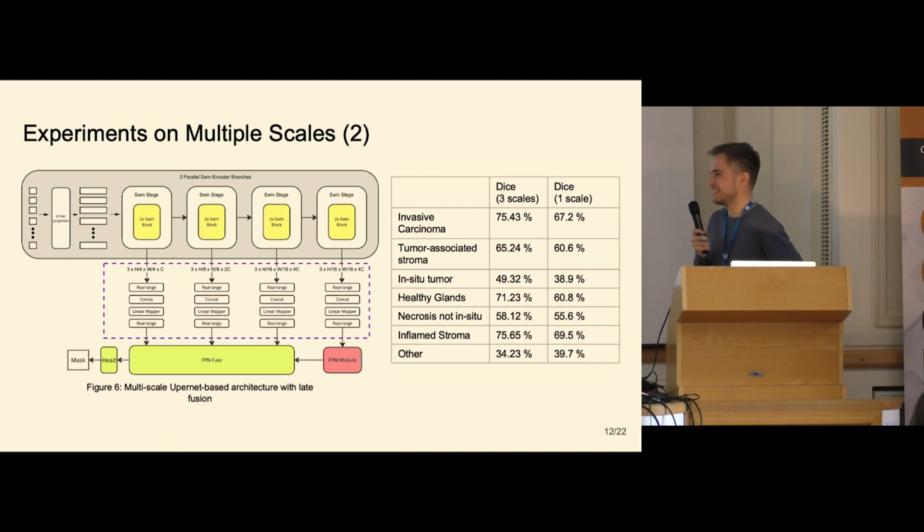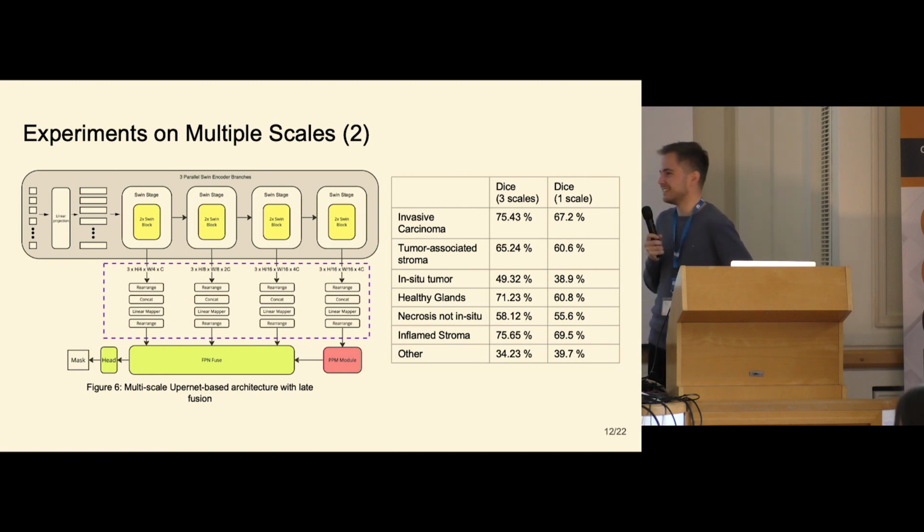I didn't understand. Color? Okay, if the data on the input that you have is also stained by some colorants. Yeah, they are stained by hematoxylin and eosin, and to normalize, we used also Macenko normalization within the fine-tuning process, so that we normalize the BCSS dataset, the fine-tuning dataset, relative to the pre-training dataset, the Brax dataset.